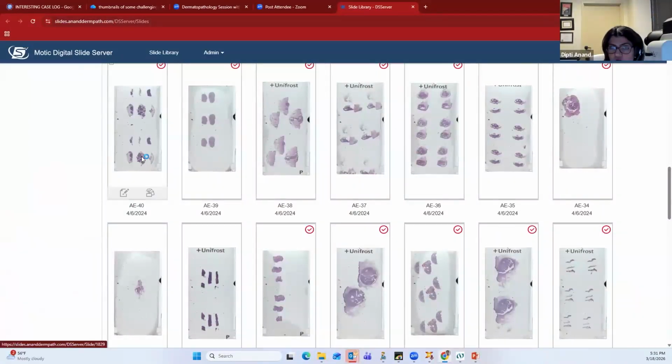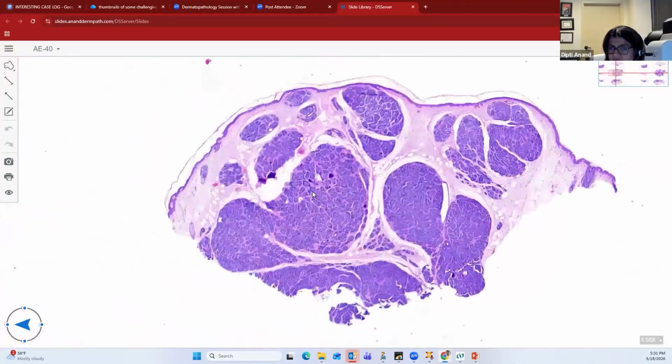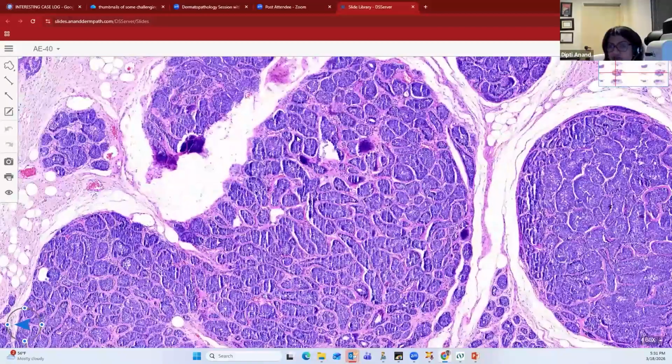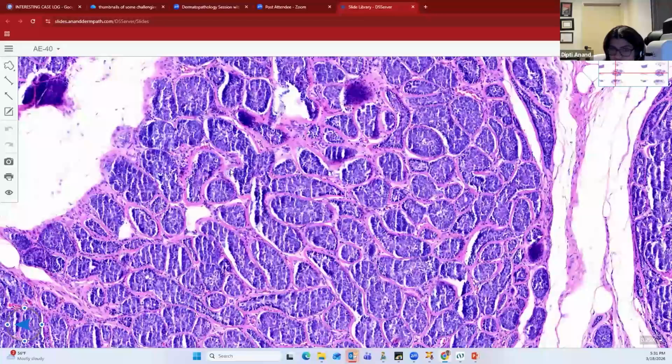The next tumor we're going to talk about is cylindroma and spiradenomas. So cylindromas and spiradenomas, these are again in a similar spectrum. They are very blue basaloid tumors. Cylindromas are classically referred to as pieces of jigsaw puzzle. So you can see these nice basaloid islands which are fitting into each other like pieces of a puzzle.